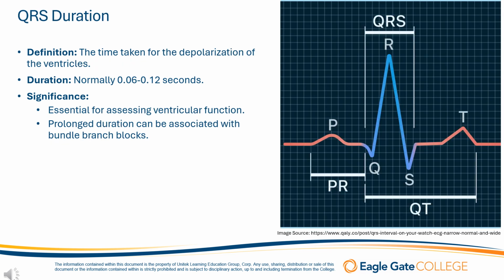The QRS duration is the time taken for the depolarization of the ventricles. Depolarization, again, is the process by which the ventricles prepare to contract and pump blood throughout the body.